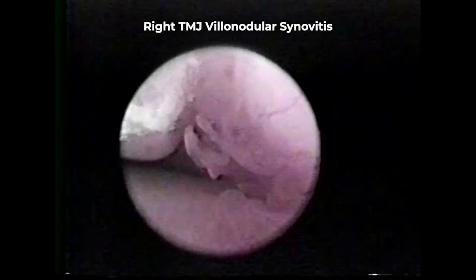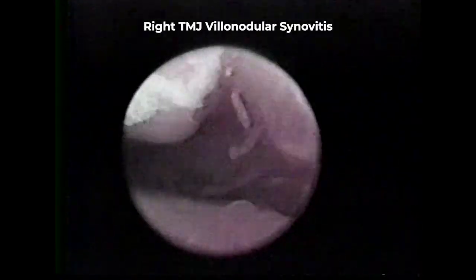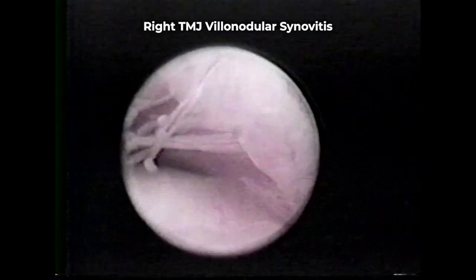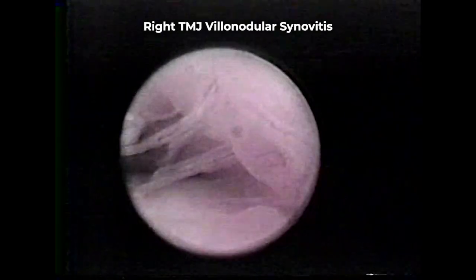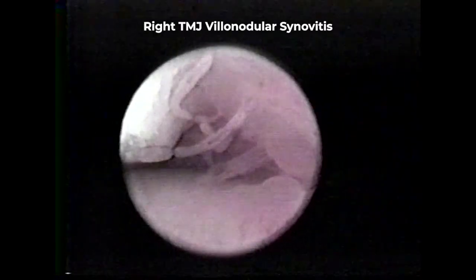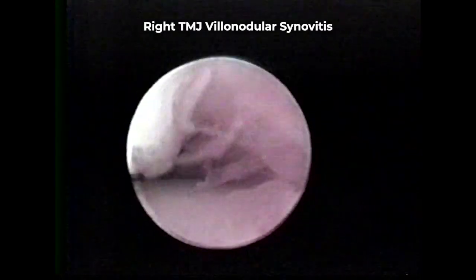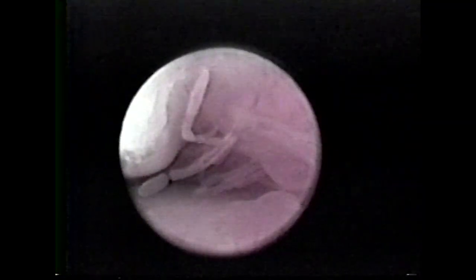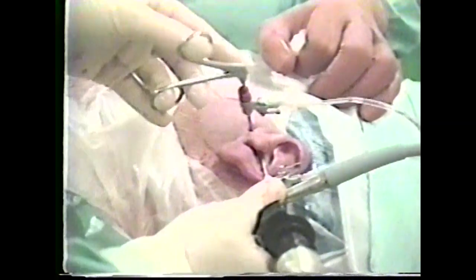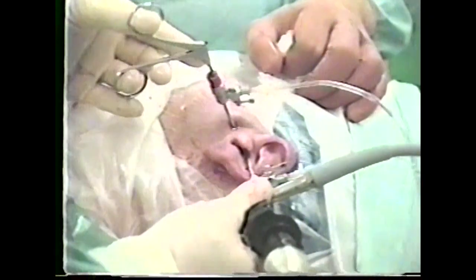In this right endaural view from a different patient, one can see the right lateral trough with a proliferative villonodular synovitis. Note the vascular channels running up through each of the synovial villi. The infralateral cannula can now be used to insert instruments into the joint.